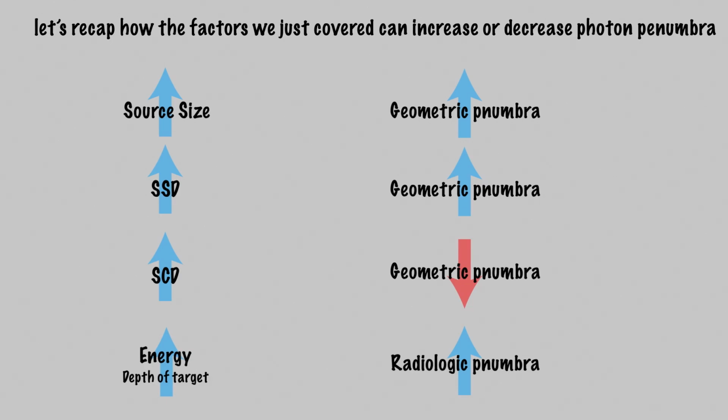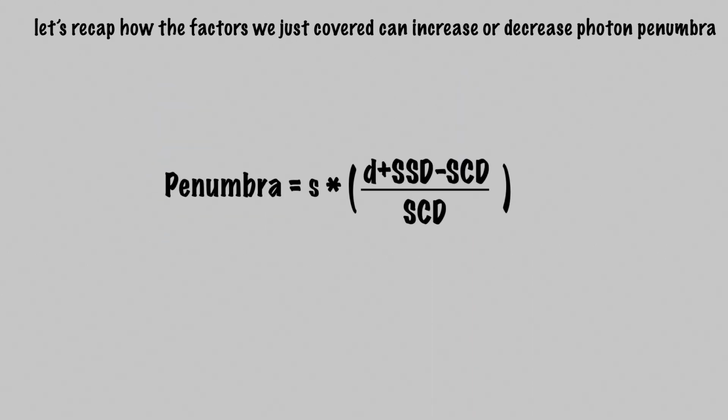the penumbra of two setups using the same energy photon beam, you can use this equation. And there you go, all you need to know about photon beam penumbra and then some.